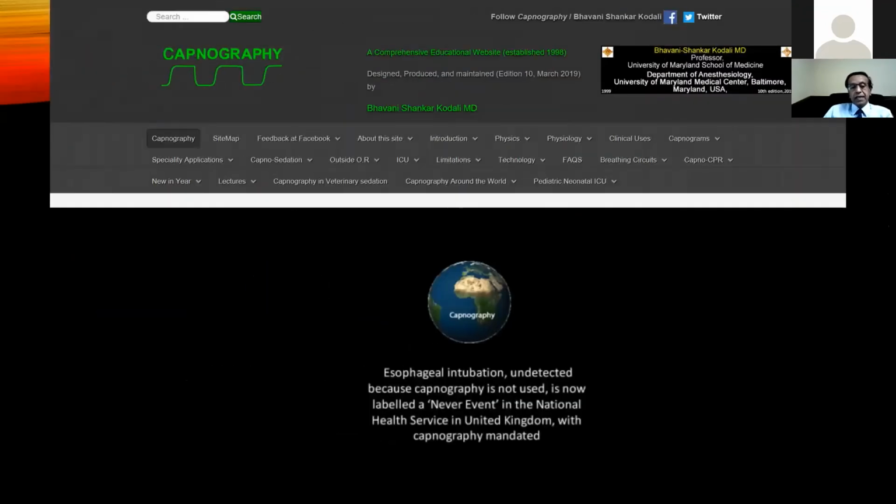Now, in England, they have advocated the use of capnography for all CPRs, because the coroner found esophageal intubation during CPR.